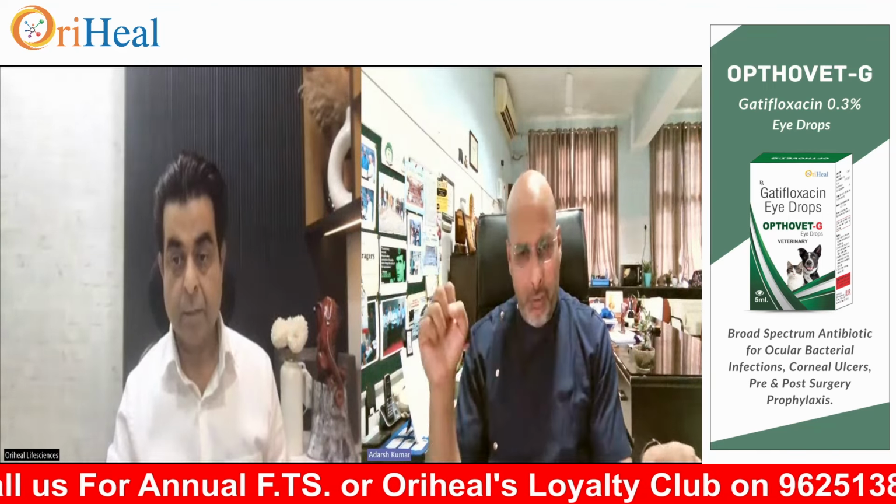Okay, so the most calculus is on this tooth. All the teeth have a triangular cusp. It has a bit of a cusp which is flat, so it doesn't matter much, but you always see that it is the biggest tooth inside, has three roots, and periodontal issues are more in the carnassial tooth. So generally we remove the pus from the gums, but again the gums fill with fluid inside.